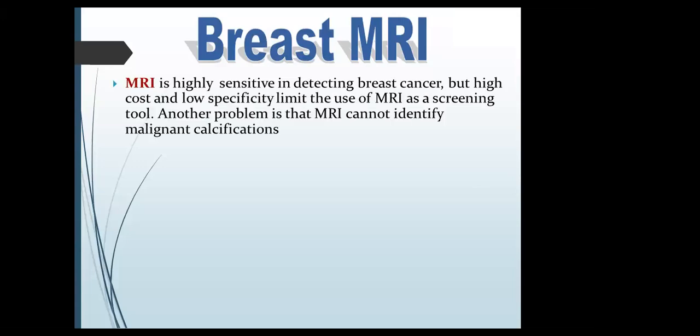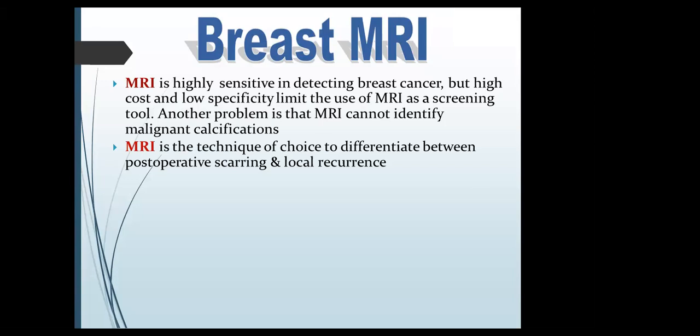Now about breast MRI. MRI is highly sensitive in detecting breast cancer, but high cost and low specificity limit the use of MRI as a screening tool. Another problem is that MRI cannot identify malignant calcification. MRI is the technique of choice to differentiate between post-operative scarring and local recurrence.